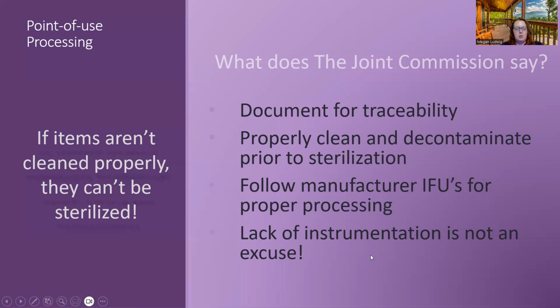Lack of instrumentation is not an excuse. So just because your facility may simply not have a second one of those instruments, the surgeon needs it back, you still have to go through that process of complete decontamination, washer decontaminators, re-sterilizing, the whole thing. Just because you don't have that instrument doesn't matter.